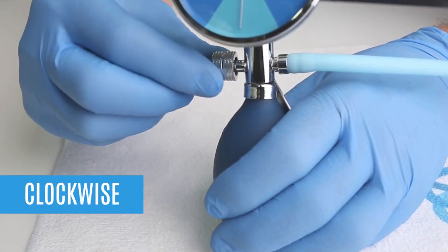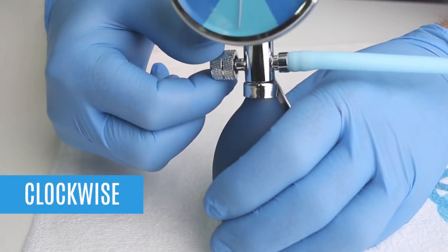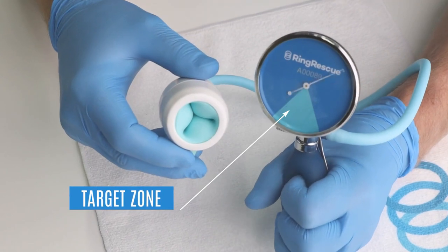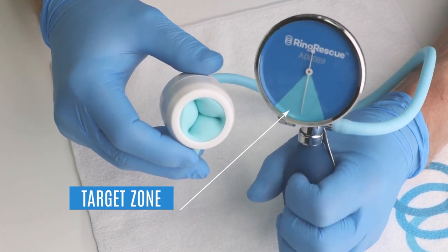Step 5: Time to inflate the device. Start to inflate the device by turning the valve closed in a clockwise motion. Next, inflate the device until the target zone is achieved.